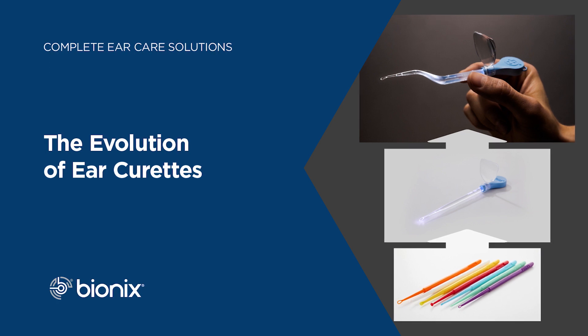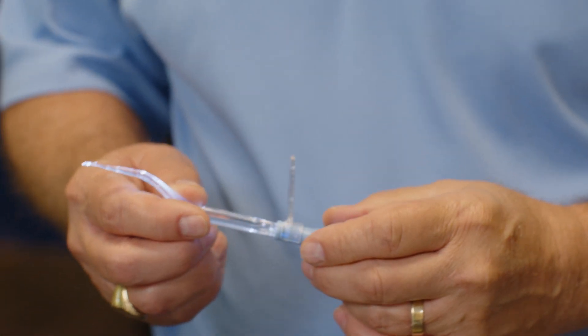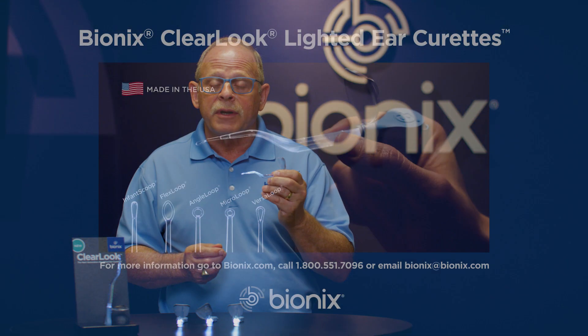Bionics Ear Curettes have evolved quite a bit since their introduction — first the safe ear curettes, then the lighted ear curettes, and now the new Clear Look Ear Curettes, where your fingers stay out of the way so you get an unobstructed view into the ear canal.